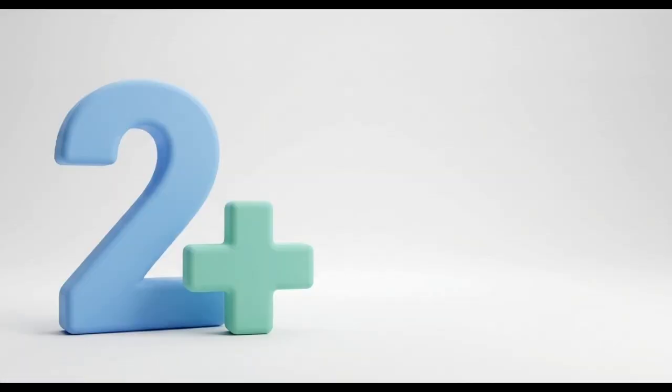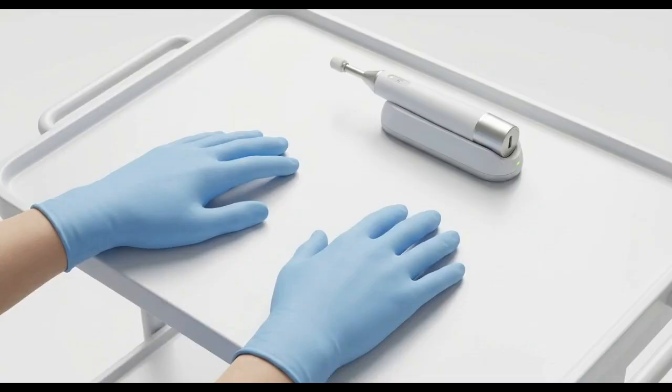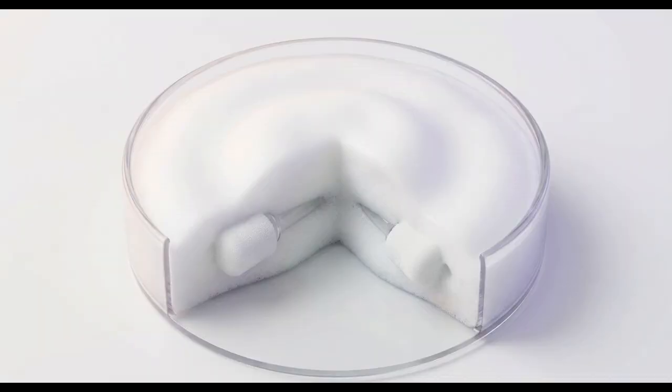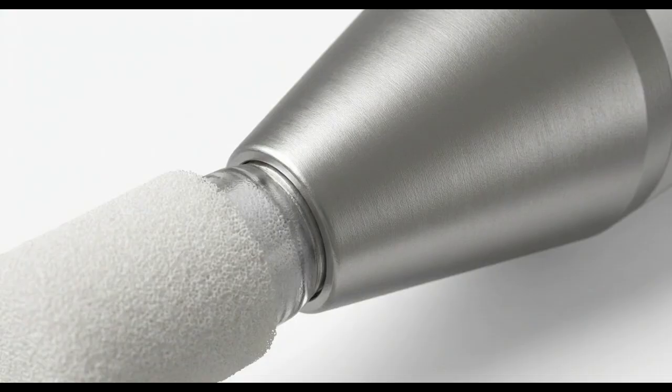Moving into the treatment phase, start the patient staging process by instilling topical anesthetic drops into both of the patient's eyes. This must be done before handling the device. Next, prepare the BlephEx charging base. Swab the lid of the base with alcohol and let it dry. Then pump the cleanser foam into the reservoir and place your treatment tips inside to soak. Remove a fully soaked microsponge tip from the reservoir and attach it securely to the end of the BlephEx handpiece.